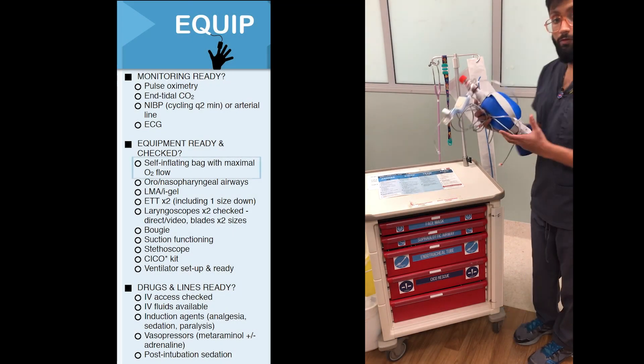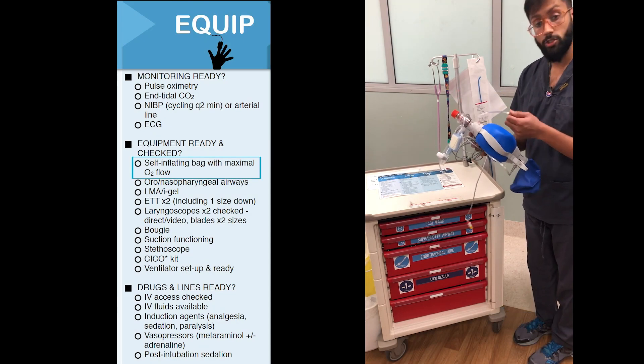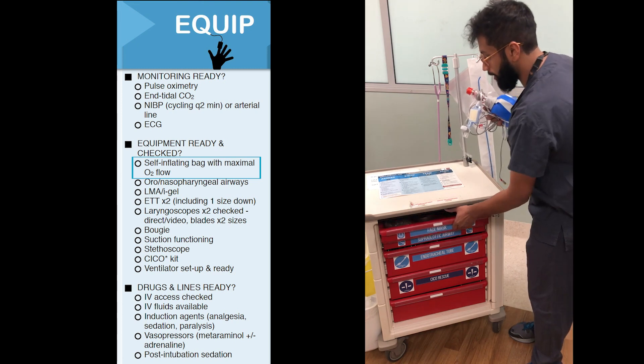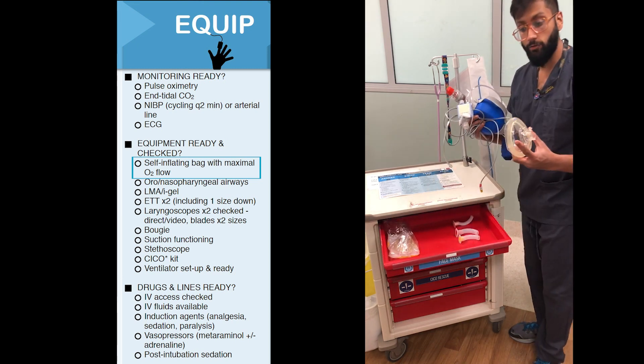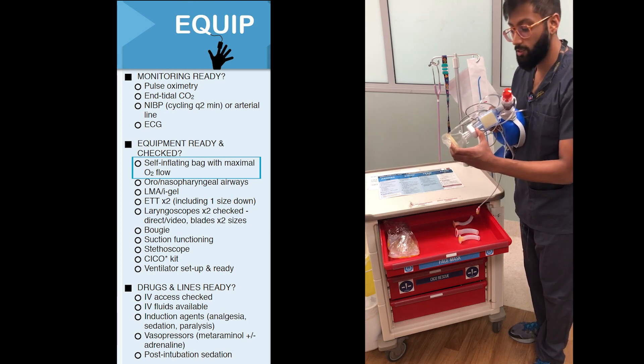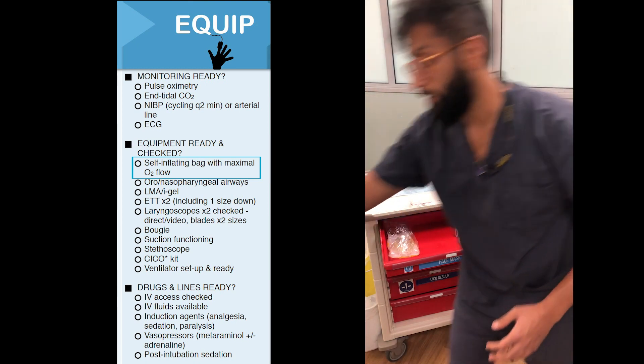The first thing you'll require is a self-inflating bag with maximal oxygen flow connected to your bed space. This is usually hanging by your bed space, and it's really important to have a mask attached for your patient. Also make sure that you've got capnography here so you can see a CO2 trace during the process of intubation.